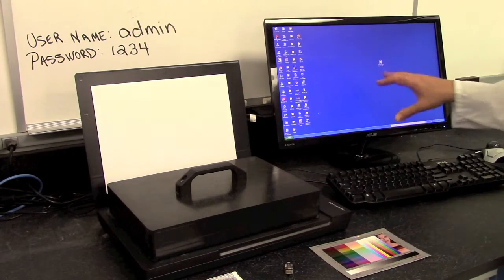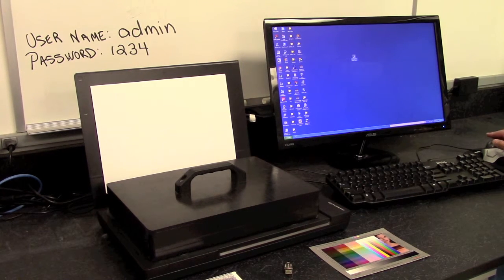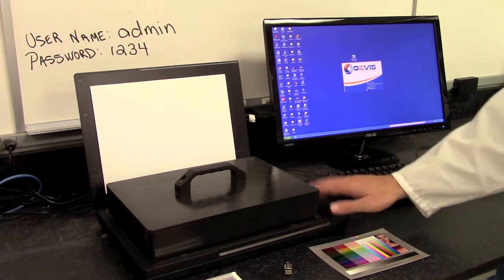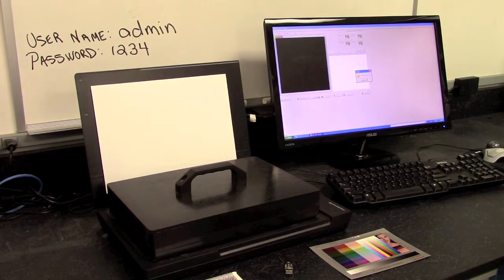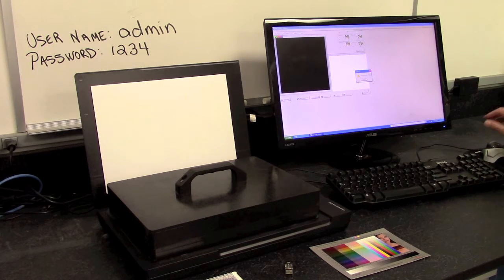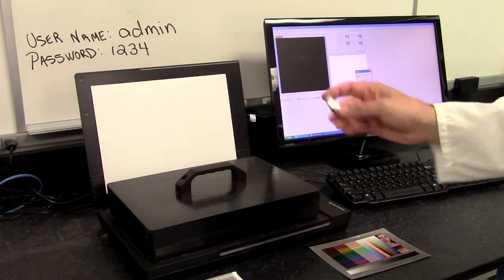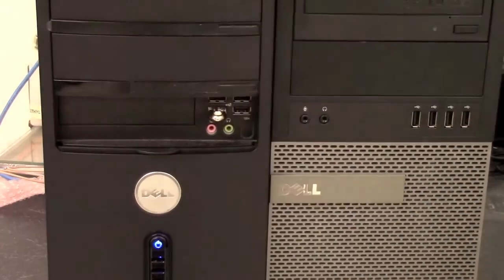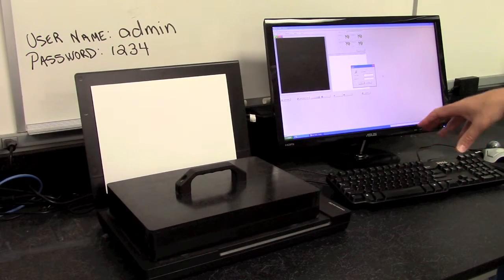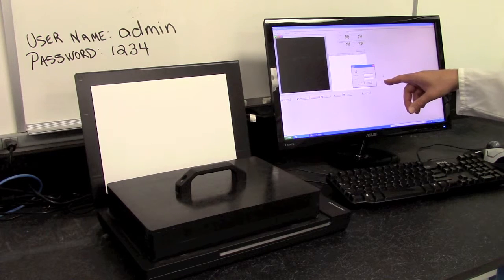and the software program. Okay, so to launch the software program once installed, when you click on the icon and you have your scanner turned on, it'll automatically search for your scanner, and if you do not have your hardware key in the computer, it will give you an error message. Once it's successfully scanned and found your scanner, it will give you a login screen.